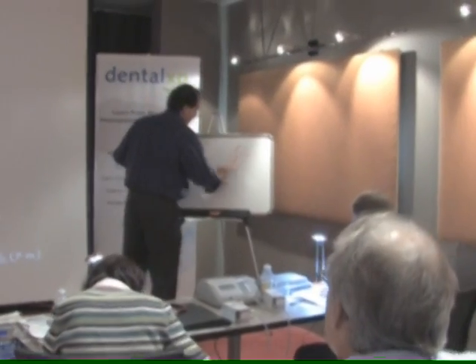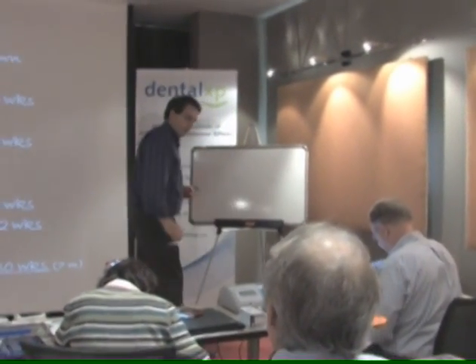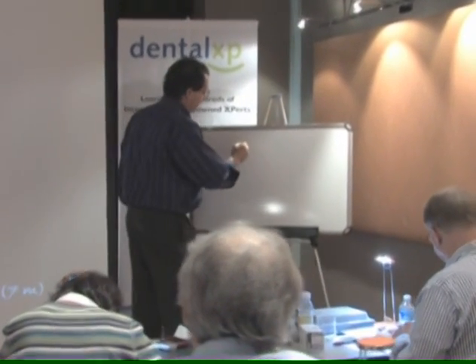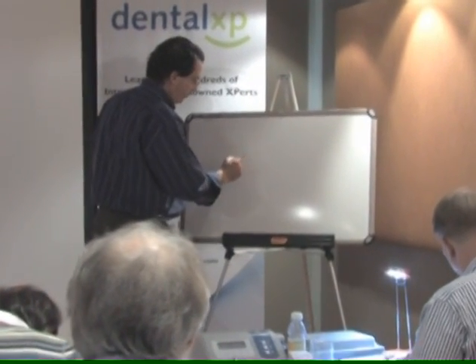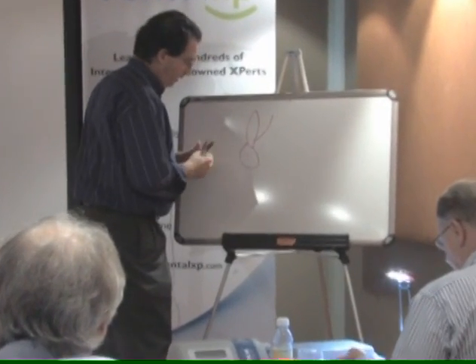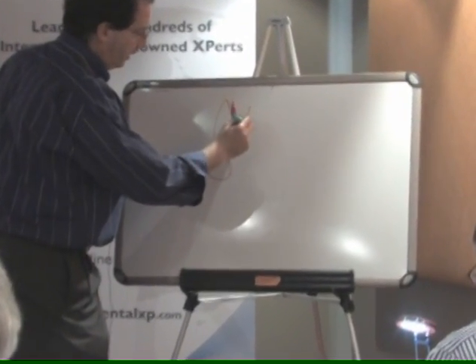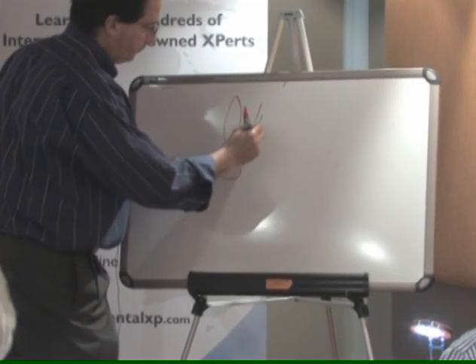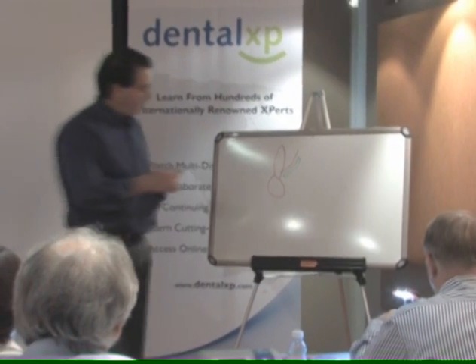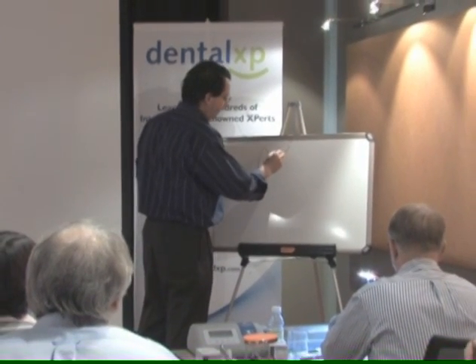What we're doing here, guys, is circumferential sutures. All right, we're doing a suture that, okay, if this is the tooth, okay, and here's your bone, and here's our graft. Now we want to pull that graft tight to the tooth, right? So what we're going to do, and this is periosteum down here.